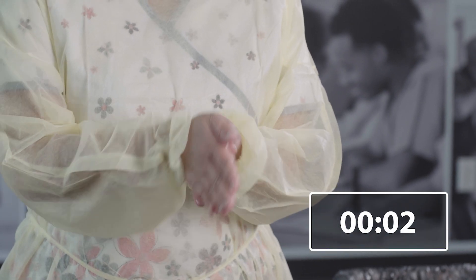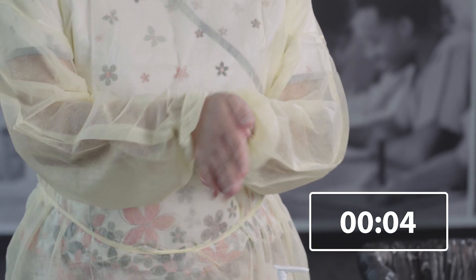Discard the gloves in the garbage bin. Perform hand hygiene with alcohol-based hand rub or soap and water for at least 20 seconds.